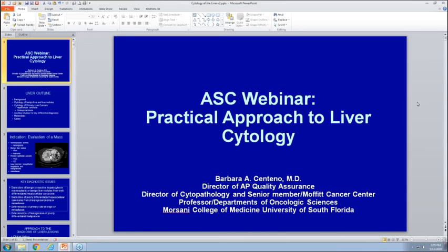Tina Fanning, absolutely. Yes, Tina Fanning, who is retired from MD Anderson right now, used to always say, as a fellow, you would get excited about mitotic figures and you'd be like, look, Dr. Fanning, here's a mitotic figure. And she'd say, oh, cells got to grow. You do see mitotic figures in growing cells, so don't get overly excited about mitotic figures, she used to say. It just reminded me of that.